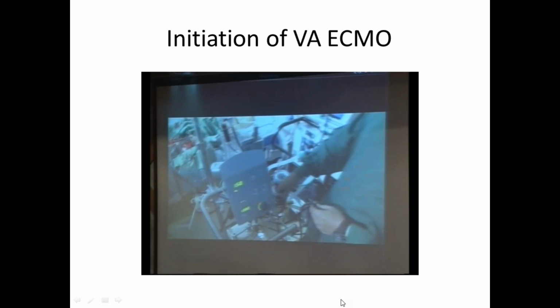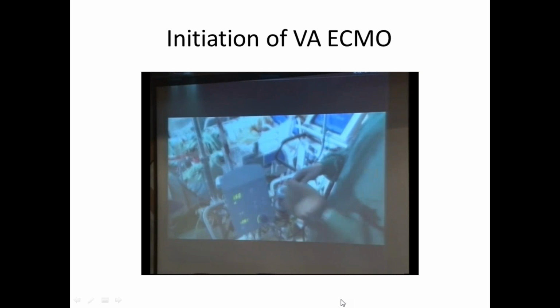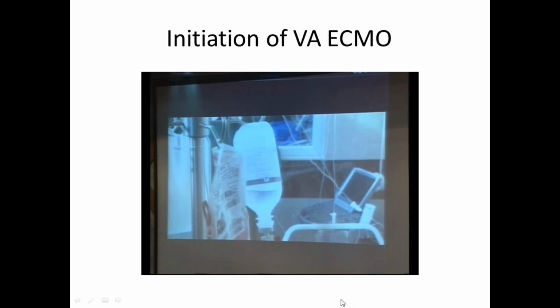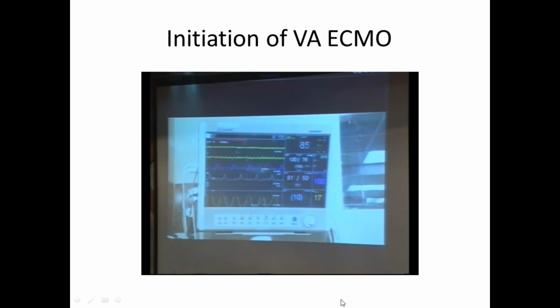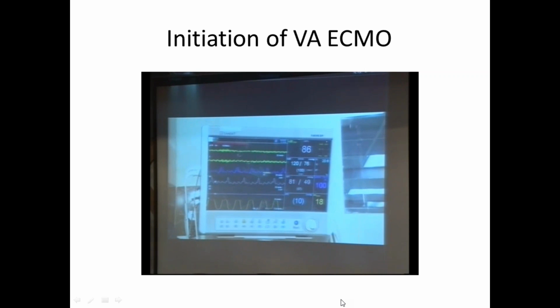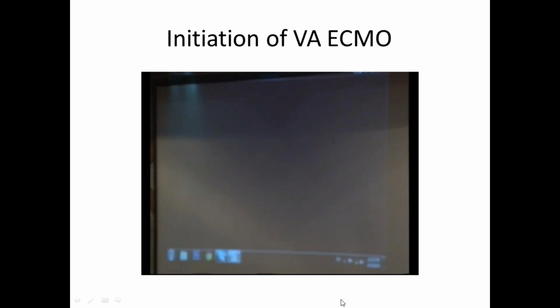So gradually now we'll increase the flow. This is gradually coming up, 85/49. What you are seeing is we have made the balloon pump 1:3. Whatever the spikes you are seeing were from the balloon pump, which was initially 1:1 and then we made it 1:3. Okay.